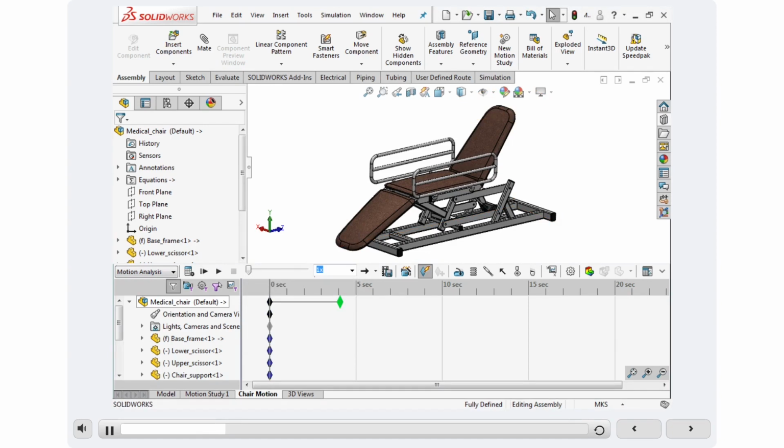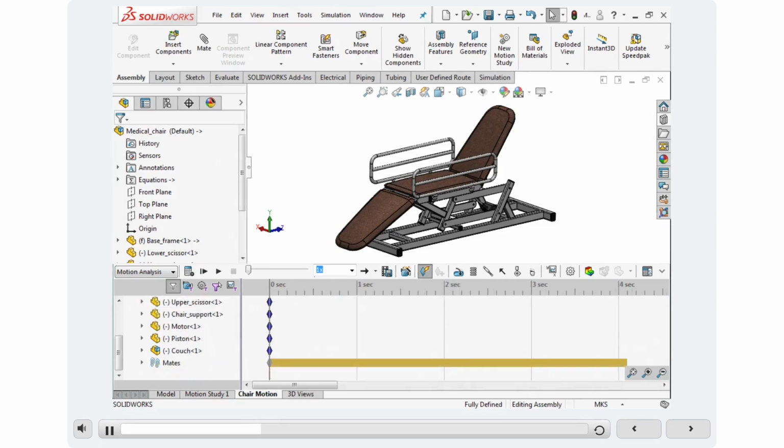Mates can be suppressed or unsuppressed within the timeline. This can add or remove stability in a motion analysis. In this case, a mate is currently keeping the chair from articulating up and down. We will keep this mate suppressed until 0.1 seconds and then unsuppress the mate, allowing the linear actuator to move the chair. The timeline has been zoomed in.